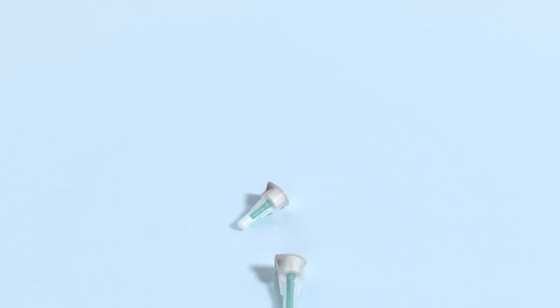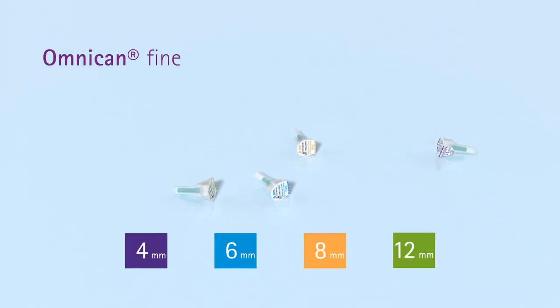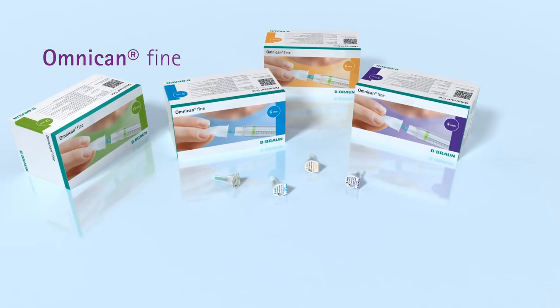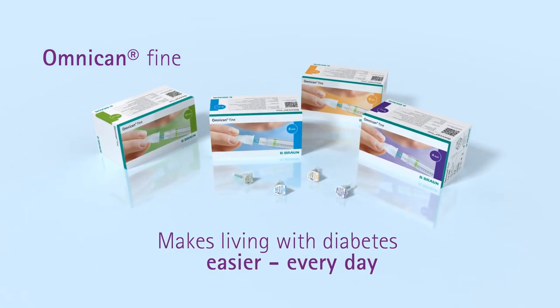The flexible material provides compatibility with all major pen devices available on the market. OmniCan Fine pen needles are available in four sizes, ready to fit personal needs. OmniCan Fine makes living with diabetes easier every day.